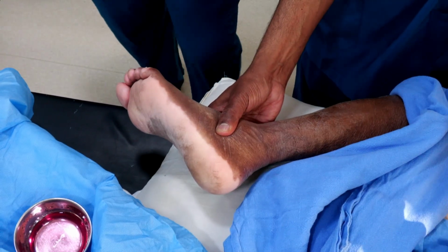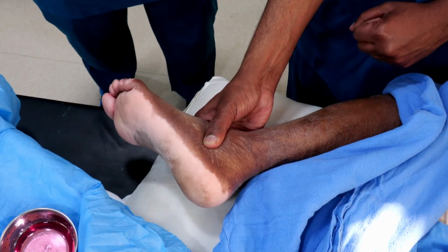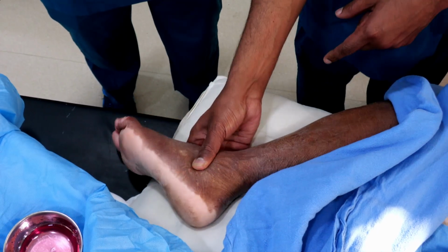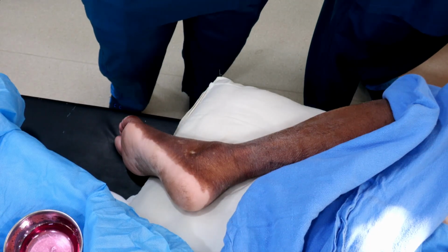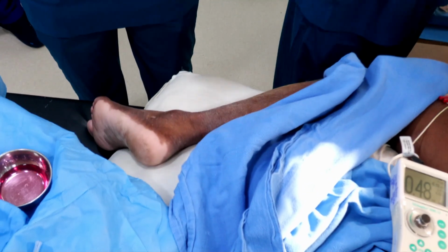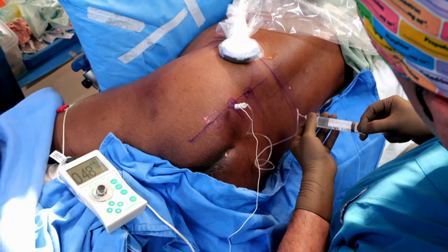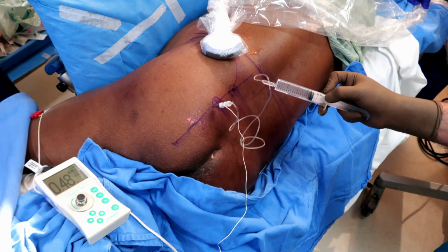Yeah. So I'm going to now inject local. So you have to always again aspirate. You have got inferior gluteal artery, superior gluteal artery. Just I'm having a bit of resistance. So probably I have to just withdraw. Can the camera person focus on the injection part? Yeah. I'm having some problem with this. So probably the needle also would have been blocked. Yes, this has come out of the block. Now there's a free flow of the local.